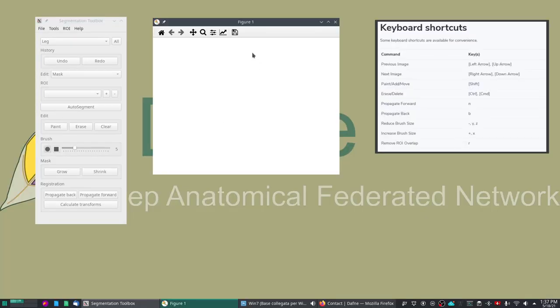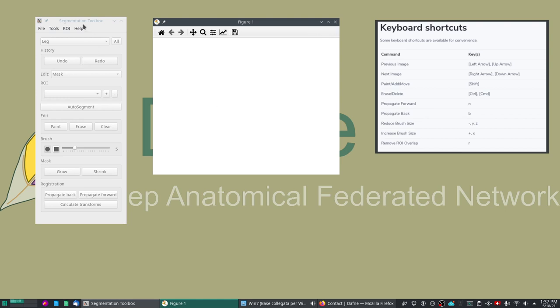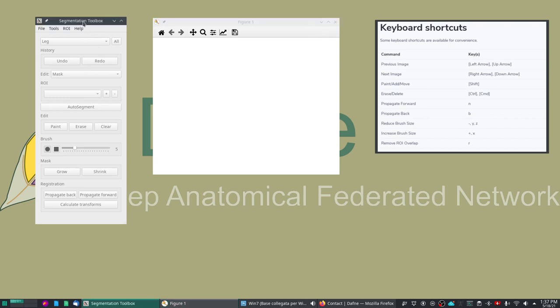So this is what Daphne looks like. It has two windows. Here in this figure window the dataset will be displayed, and in the toolbox which is a separate window are all the tools that we can use to perform the segmentation.